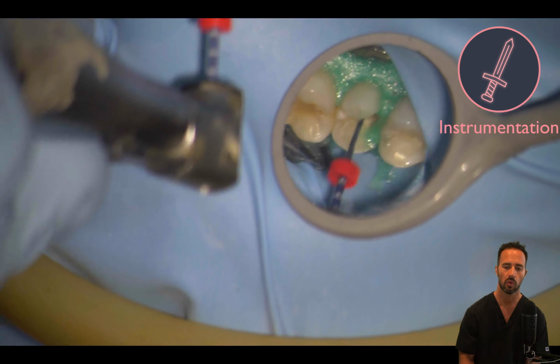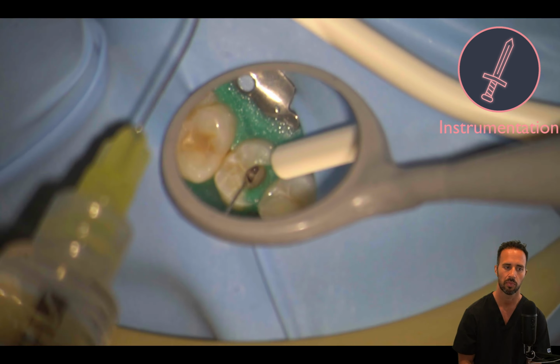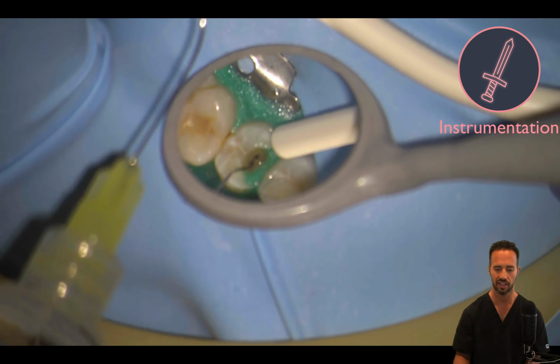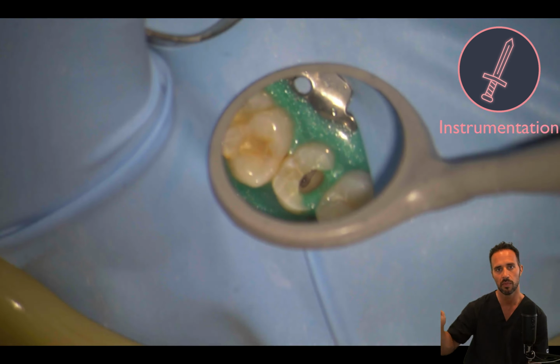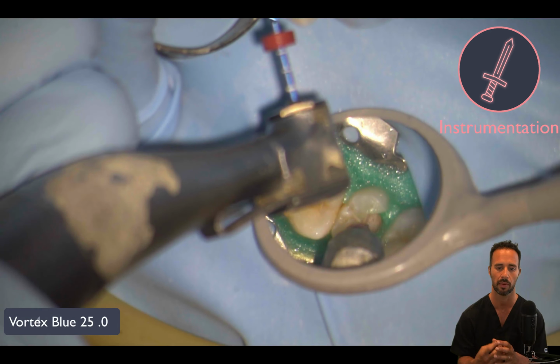The reason that that's so important is because if the flutes are filled with dentinal debris, okay, they cannot cut. So it's very important. It's like trying to have a spoon that's full of sugar, let's say, and then going back into the sugar bag and trying to remove more sugar. The spoon is already full. You have to remove all that sugar from the spoon before you can grab more sugar, right? So you've got to have an empty flute in order to do the proper cutting.